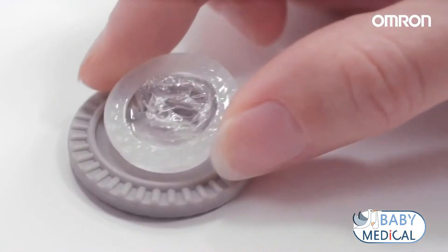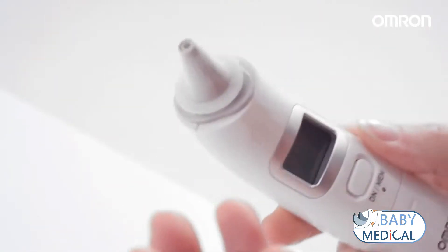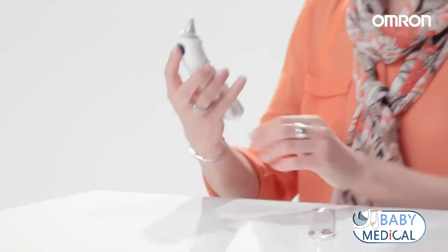Always use a new and undamaged probe cover. Use the connection ring to place the probe cover correctly. To start a measurement, press the ON MEM button. After two beeps, insert the probe into the ear as far as comfortable. Press the start button.